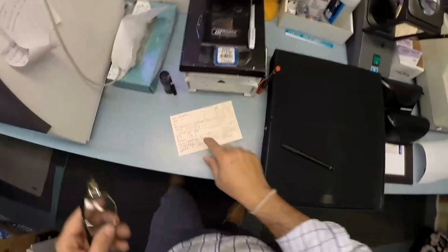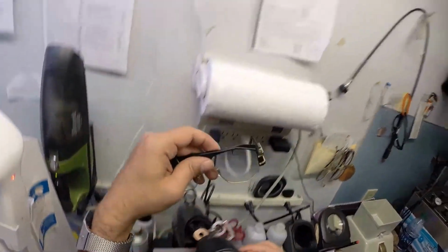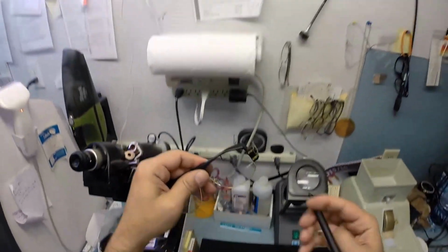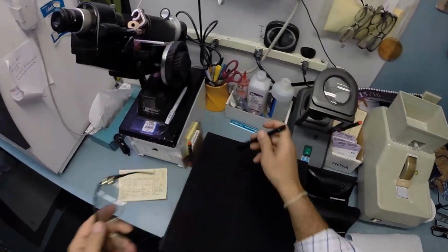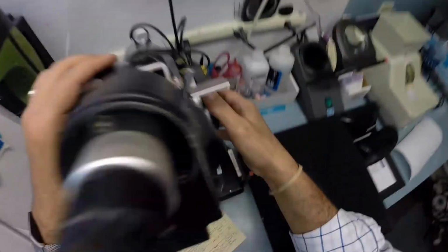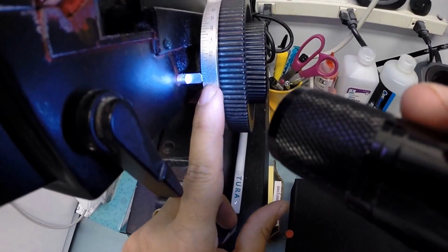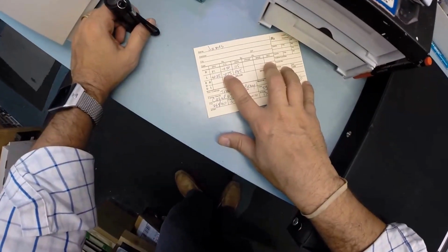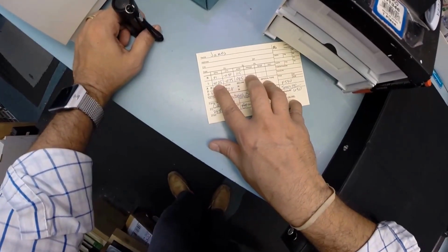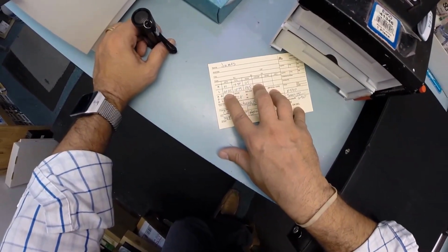So let's come down here, spin the axis wheel to 95, exactly halfway between 90 and 100. Put it in over that red dot, which you can barely see. Let's darken that, because we'll need to measure that later on. Put it in over that dot, measure, and I am getting plus 25, 1 tick mark over the 0 into the black. We're going to check the 3 steps of astigmatism correction. Remember high school algebra, we add 2 like signs together? Yeah, me either. Let's use today's terms. If you had 25 cents and someone borrowed 75 cents, you would be 50 cents in the red.